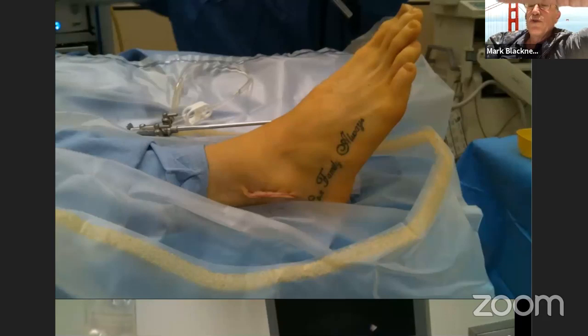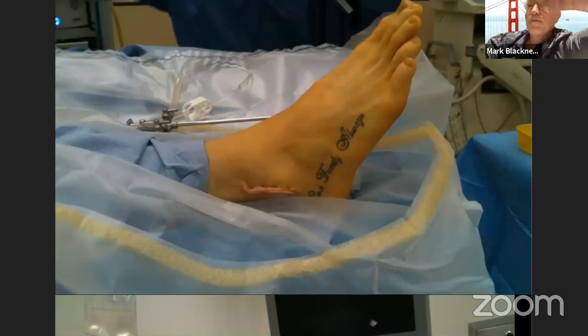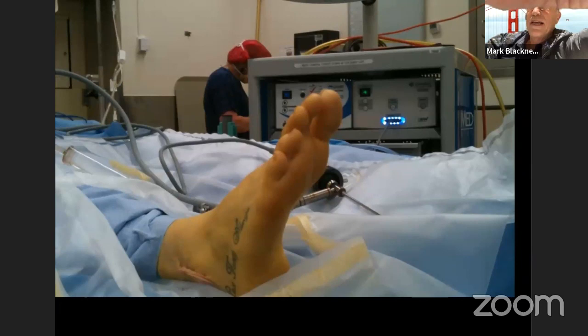So I'm going to move on to perhaps focus a bit more on the surgical side. So this is my setup for arthroscopy, very similar to the other ones that you've seen. I like the foot just on the end of the bed. I don't generally use traction. I have a little pouch which helps to catch some of the fluid, and I just use gravity feed saline. Just another view with the, as a surgeon, you're standing at the end of the bed, you're looking up towards the head, and the screen is in the center of the table.